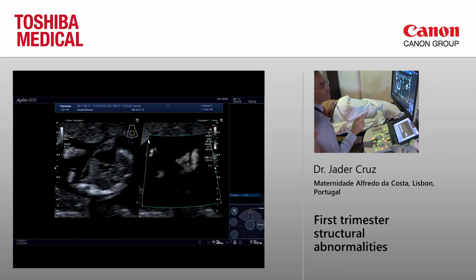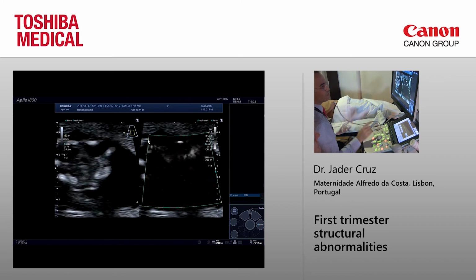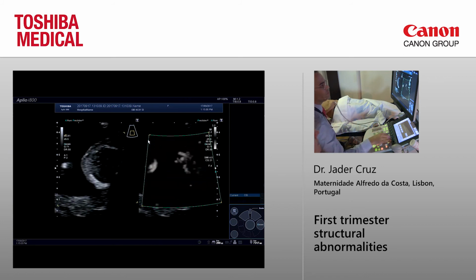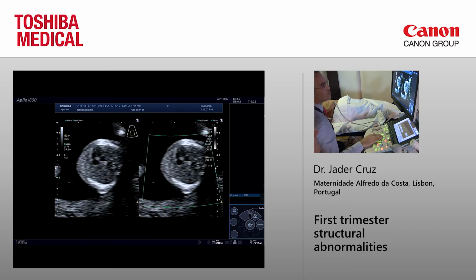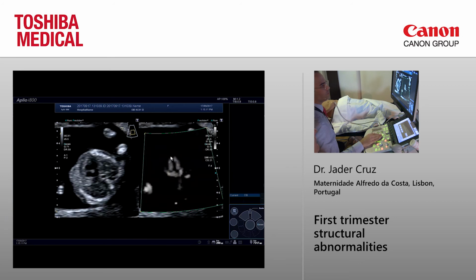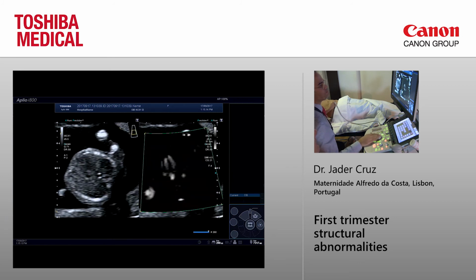This has actually no real preset, so that's more or less a raw image. We can improve it a little bit more, but just to show you, you can see the four chamber view very nicely. You can see the interventricular septum very nicely.